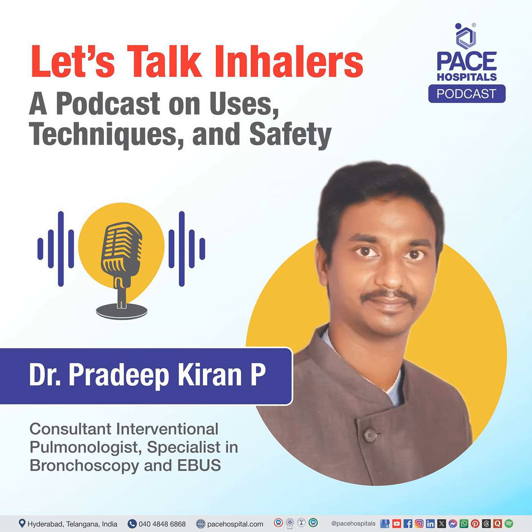Second, there may be oral ulcerations, which can be avoided by regularly rinsing your mouth once you have taken an inhaler.